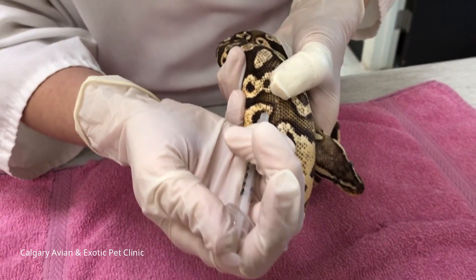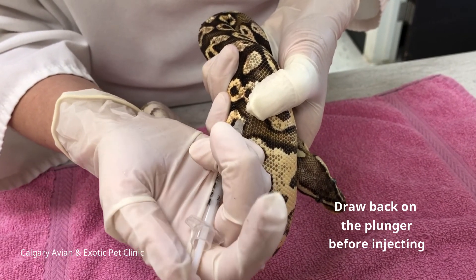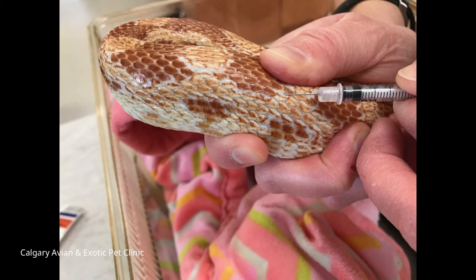After you withdraw the needle, place your finger over the site of insertion for a few seconds to prevent leaking of the medication. When the next treatment is due, use the muscles on the opposite side of the body and keep alternating sides with each treatment.